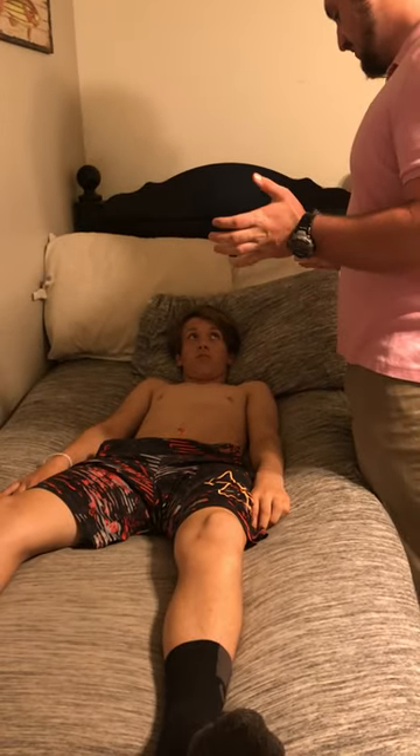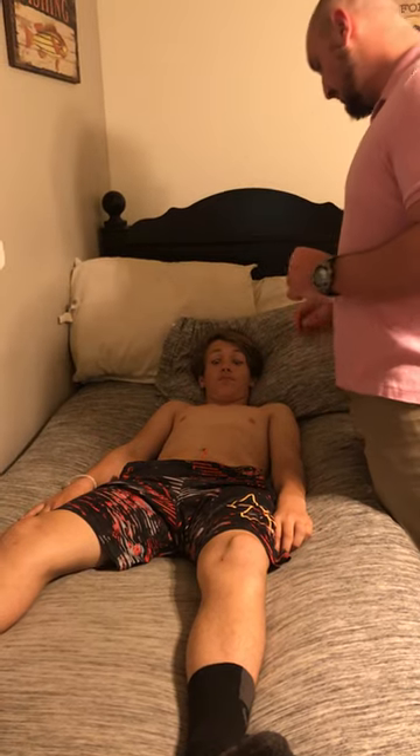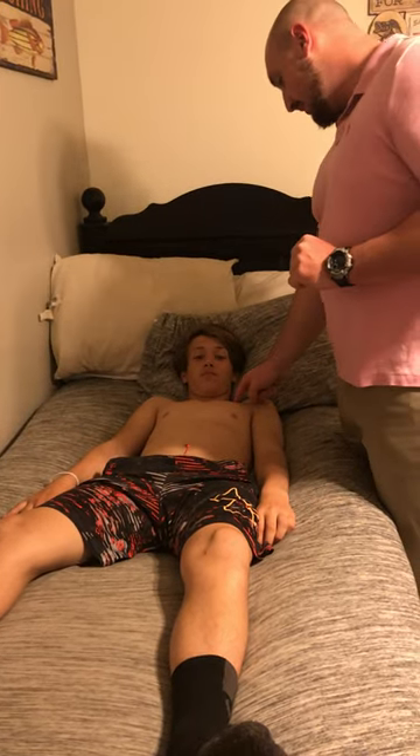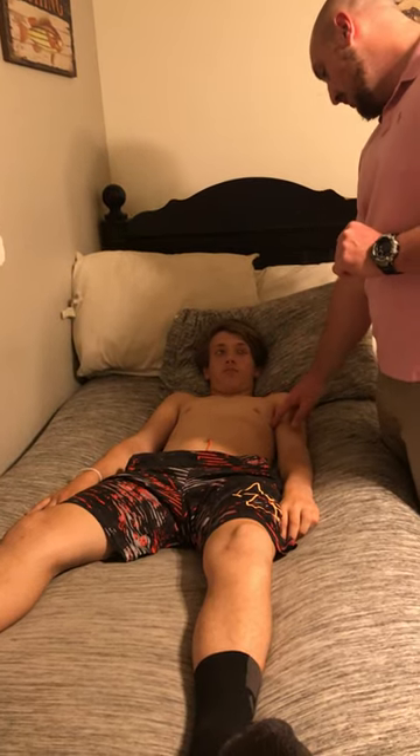All right, so Matthew, today we're going to have an EKG. I'm going to place several electrodes all over your body — there's going to be 10 of them in general. There's going to be one right here, one right here, two down here, we're going to have two right here, and it's just going to be an L down here.